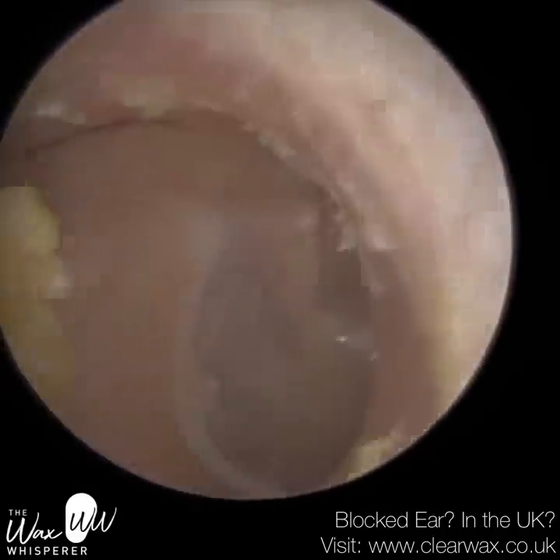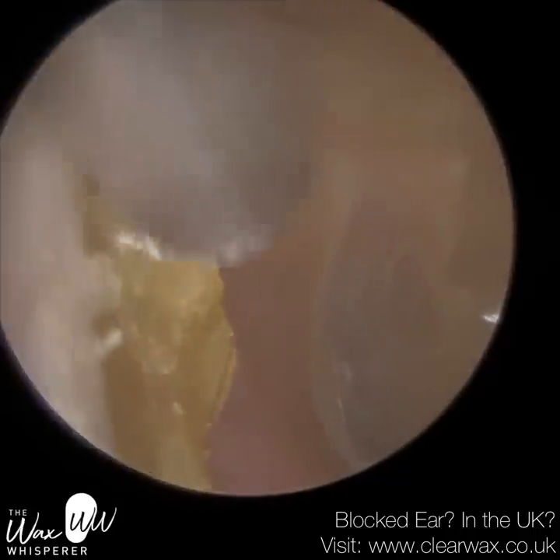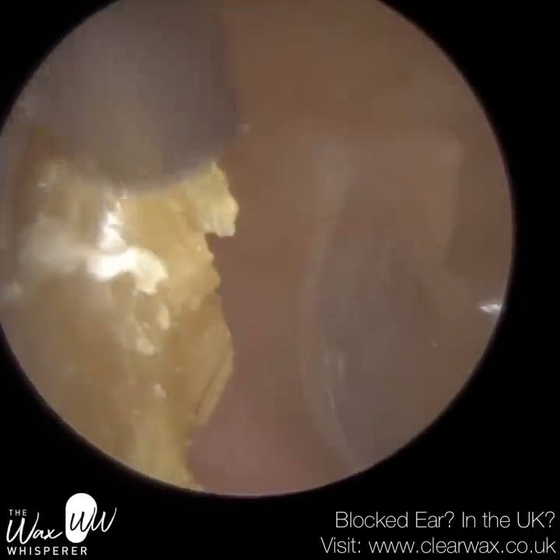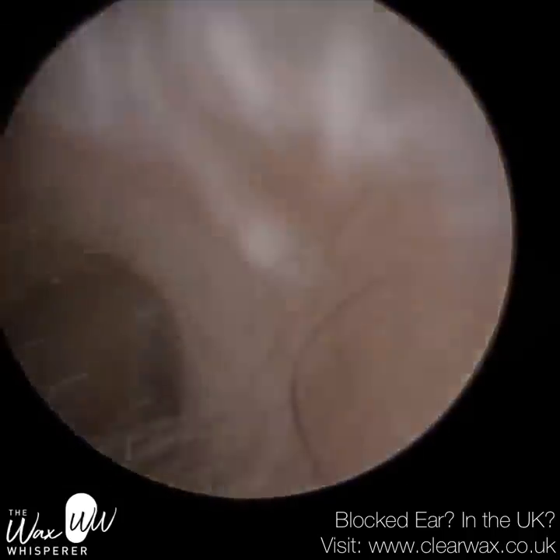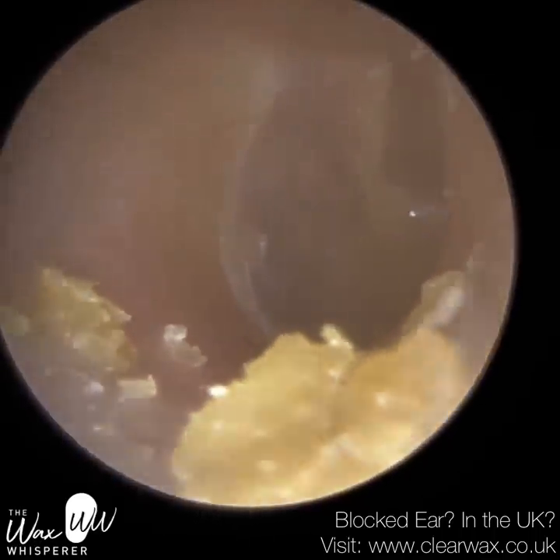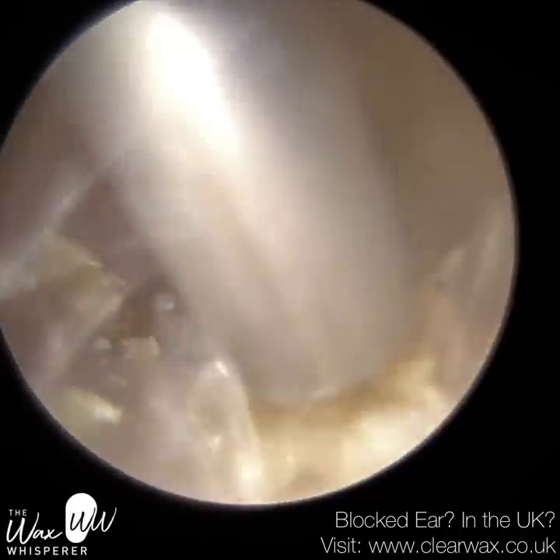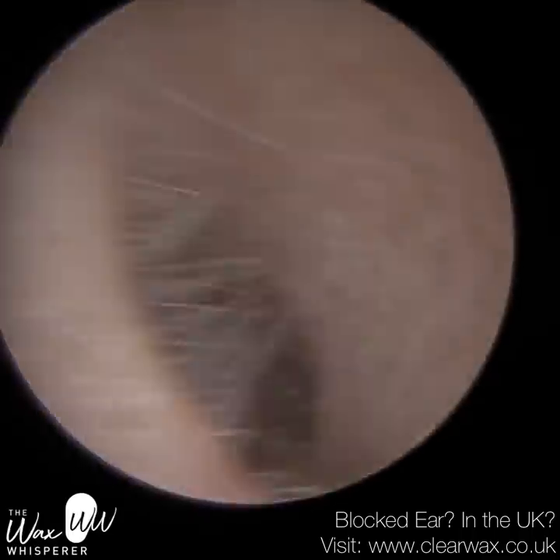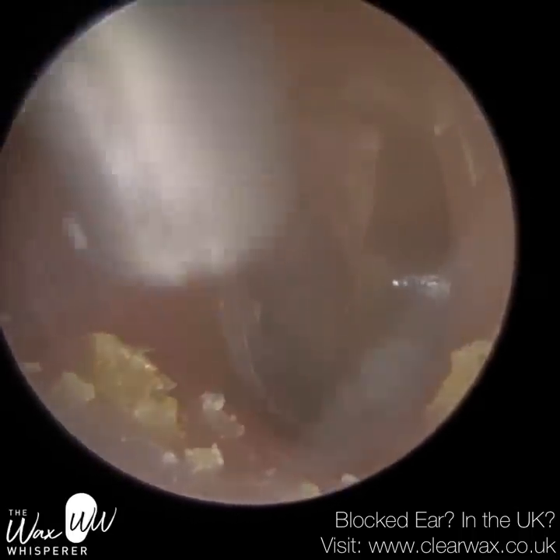It varies from individual to individual when it's stimulated. An average stapedial reflex occurs around 90 to 95 decibels, though there is a bit of range in that. If you've got a conductive hearing loss, you may not have a stapedial reflex if there's some sort of occlusion in the ear canal or middle ear. But we can actually see it here — I've never seen it myself before, only in textbooks and surgical videos.